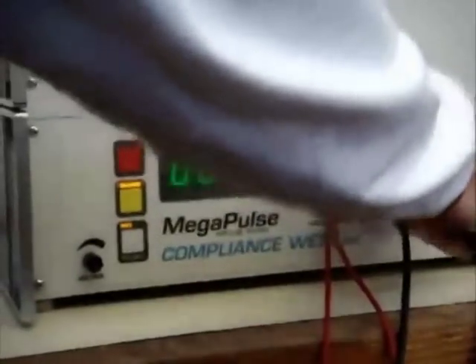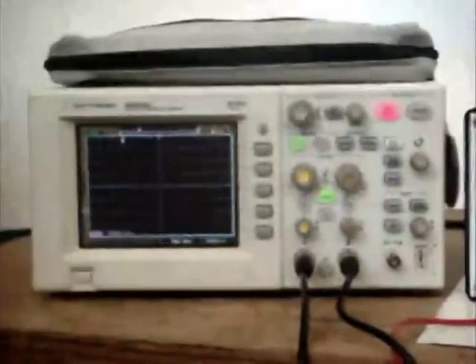Note: be sure the BNC cables you are using are actual 1-to-1 oscilloscope leads. Use of other cables with the correct terminations may not yield correct results.